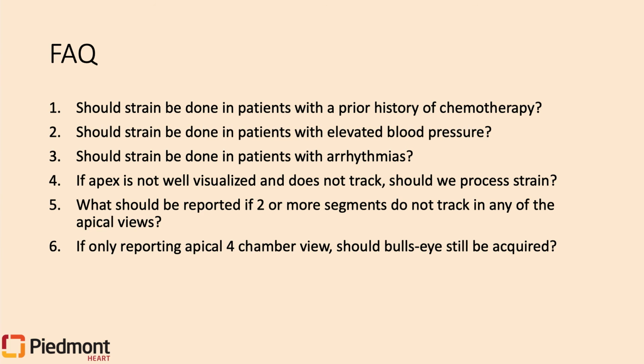Our writing committee is working on statements that can be utilized in our report. For example, along the lines of global longitudinal strain is X, or apical 4-chamber strain is Y, and that's where we will incorporate those numbers.